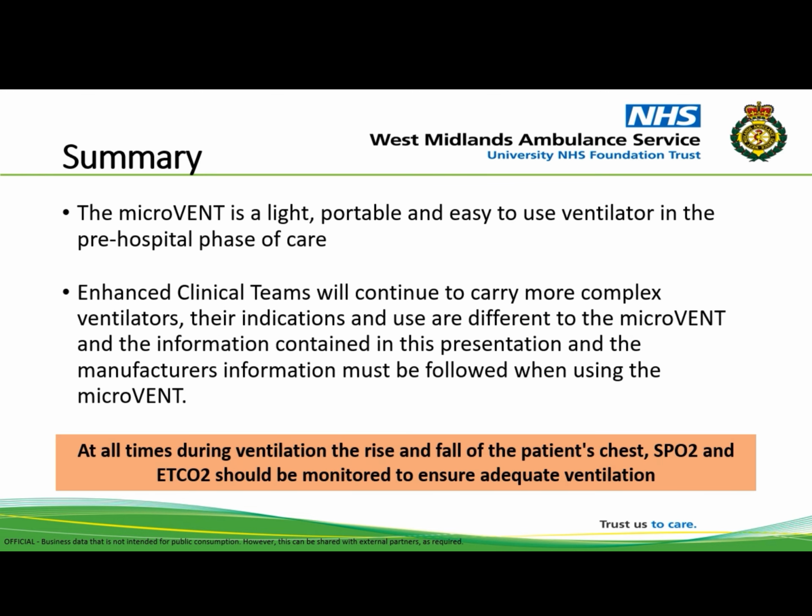In summary, the MicroVent is a light, portable and easy to use ventilator in the pre-hospital phase of care. Our enhanced care teams will continue to carry more complex ventilators. Their indications and uses are different to those of the MicroVent, and the information contained in this presentation and the manufacturer's information must be followed when using the MicroVent. At all times during ventilation, the rise and fall of the patient's chest, oxygen saturations and end tidal CO2 should be monitored to ensure adequate ventilation.